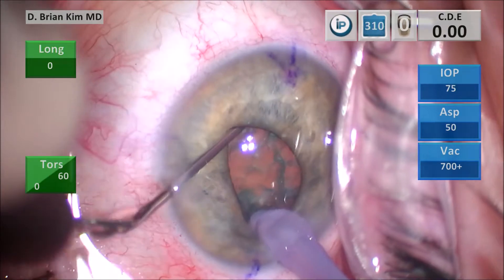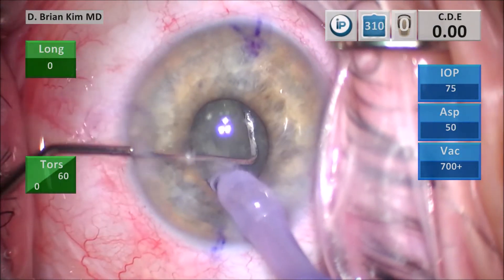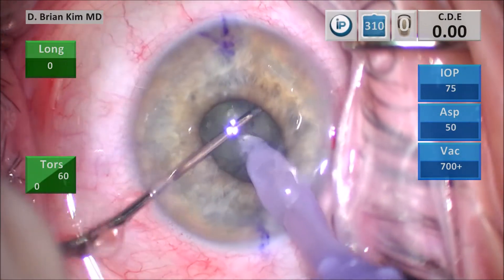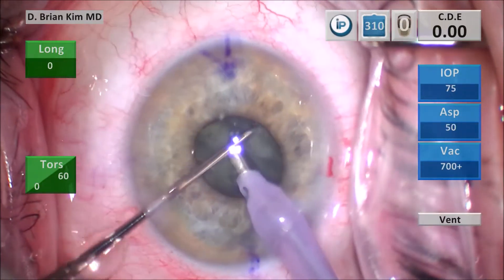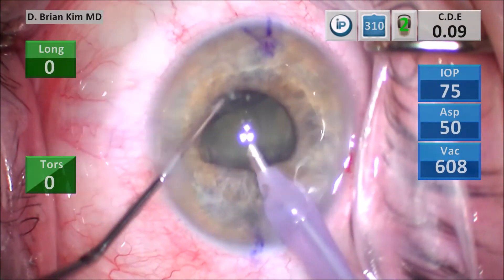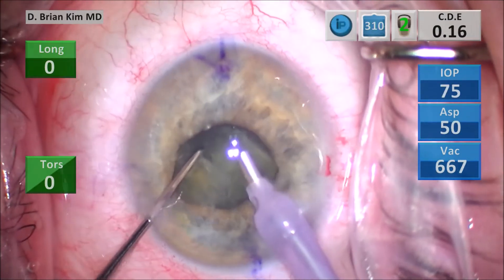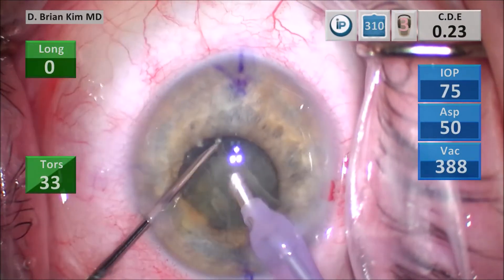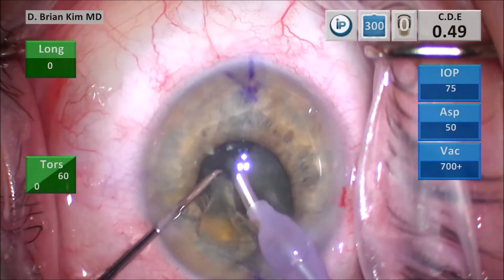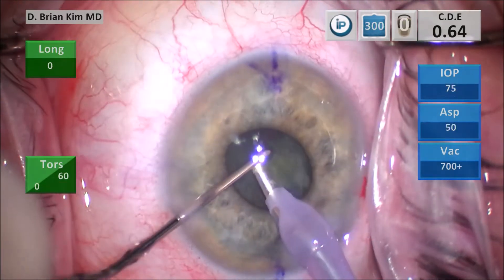I perform the double chop, place the chopper out to the equator, hold it from below, then push down with the phaco tip and fracture the lens. I place the chopper out to the contralateral equator and fracture the contralateral hemi nucleus. Within a few seconds I'm able to create three lens pieces, prolapse one piece out, and start emulsifying. I use mechanical fracturing forces to break up the lens into smaller pieces.